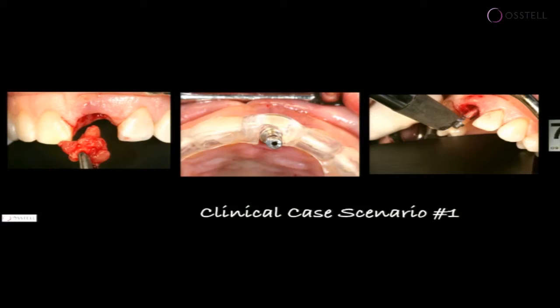You have to know some of the details of this preparation technique in interpreting these stability numbers, because you could just be looking at an overcompressed implant into a small space, or in this case, and I think, Peter, you can verify, this was done with a standard drilling protocol with the tapered implant, so that we're looking more at the true density measurements or implications of the density measurements around this implant as it's placed.